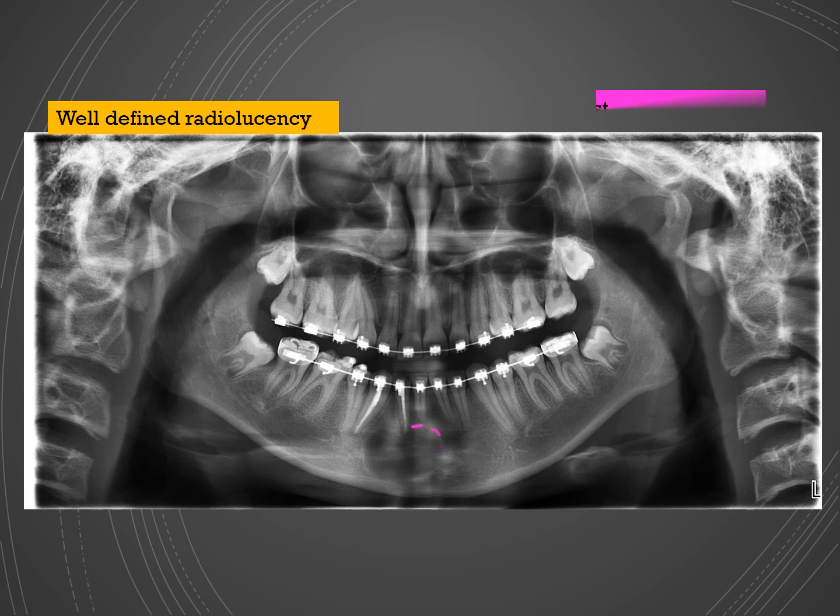For example, this is a case of non-vital 4-1 anterior teeth, which has got non-vital because of probably force during orthodontic treatment. And you can also see that the cystic area has actually caused the drifting of the root of the canine. Yeah, I think it's a 4-2. Probably I got the tooth number wrong.